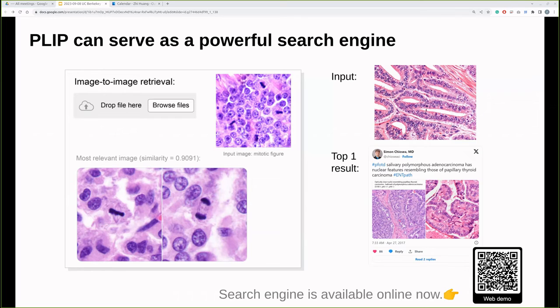And I'm not sure if you have done this before, but you can use your visual representation to get the feature importance for all the whole slide images on the TCGA data. They have the survival, they have the tumor grade. Maybe you can show just by using the number of mitotic bodies, or you can show your method can be a mitotic body detector, and in the end, it can be a different kind of diagnosis. Exactly. So this is actually our ongoing project. Now it's under revision. Hopefully I can have the opportunity to disseminate the latest research in the future.